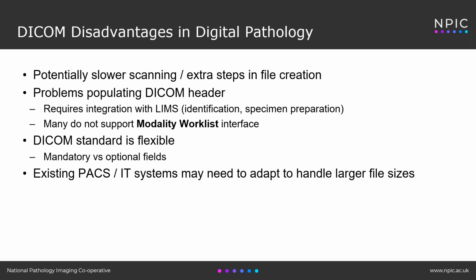There's also problems populating the DICOM header. This element requires integration with the laboratory information management or LIMS system in terms of identification and specimen preparation. And many of these LIMS systems currently do not support the modality worklist interface that has been so successful in radiology. So getting this data out of the LIMS system is problematic.